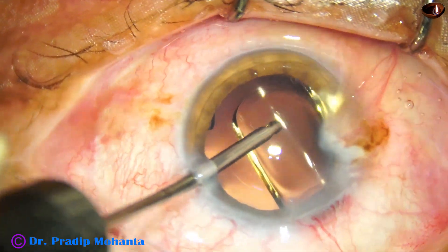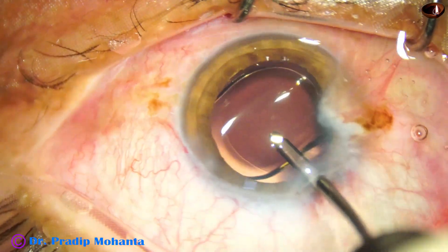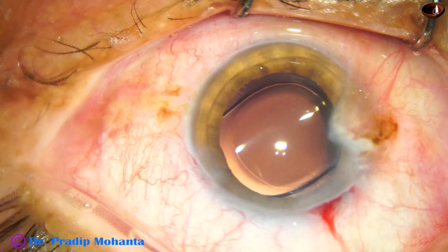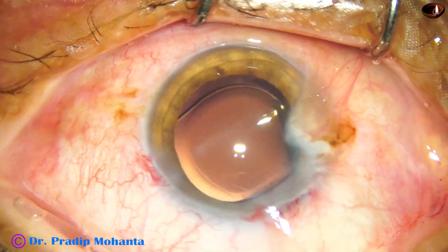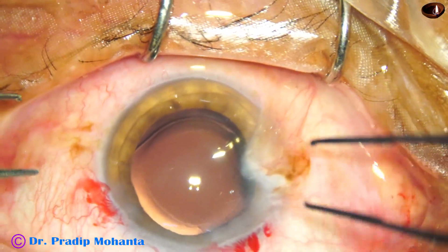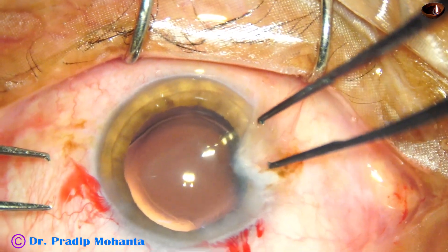This is hydro-implantation of the lens — a hydrophobic acrylic single piece monofocal intraocular lens. Now since I am going to do the pterygium surgery, I fill the anterior chamber with visco.